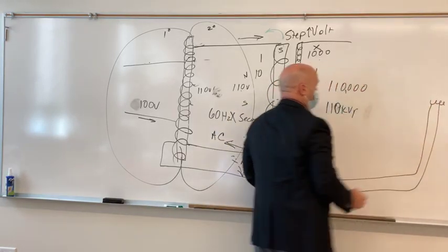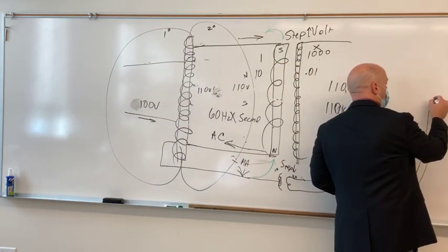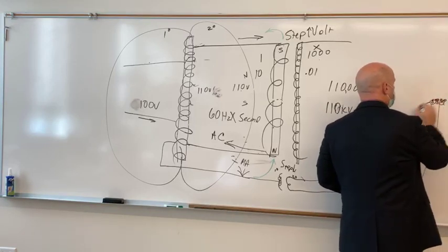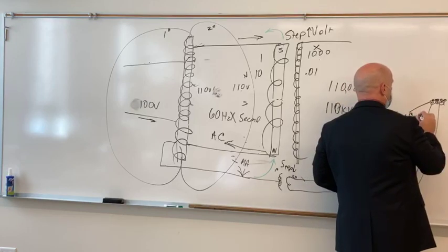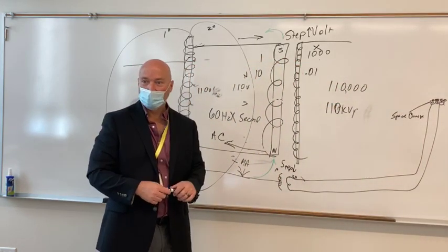Okay? Now we have low voltage, and we have a set amperage, so that whenever we hit our prep button, we're going to flood this thing with electrons to create a space charge. What else do we call space charge? Hot charged particles, emission of hot charged particles.